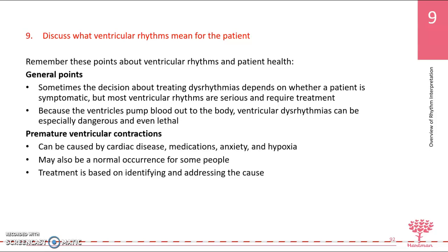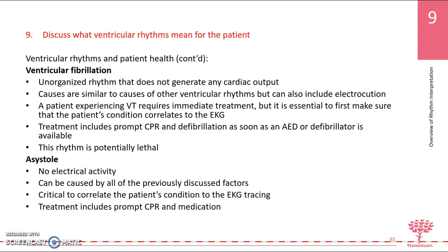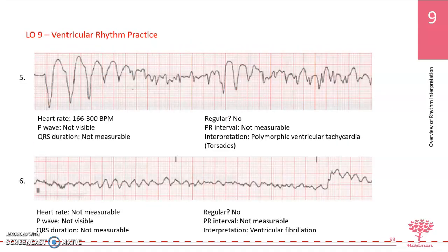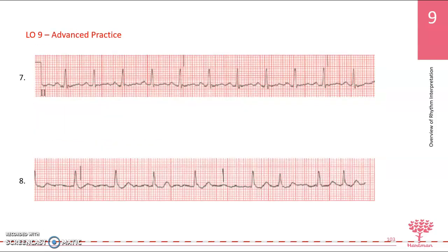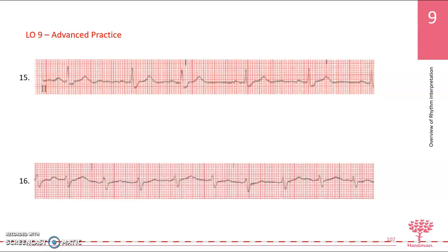So make sure that you go through these and remind yourself of what you're looking for in the ventricular rhythms, and quiz yourself. Go through these and quiz yourself, and we'll go through some more rhythms in the next session and finish off this presentation.